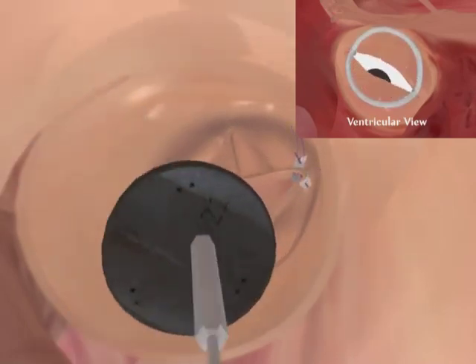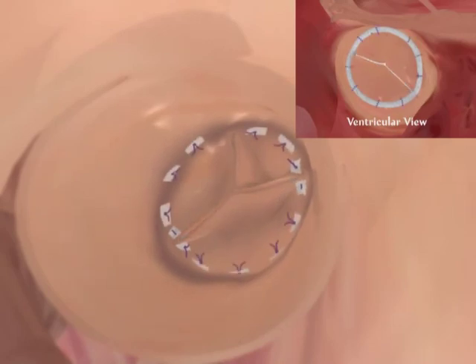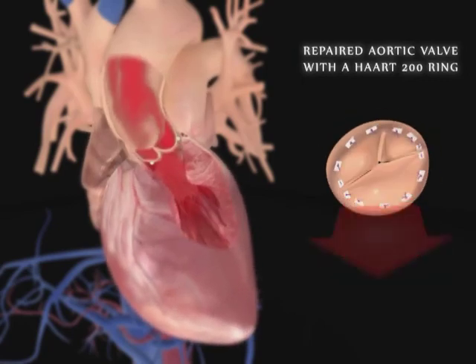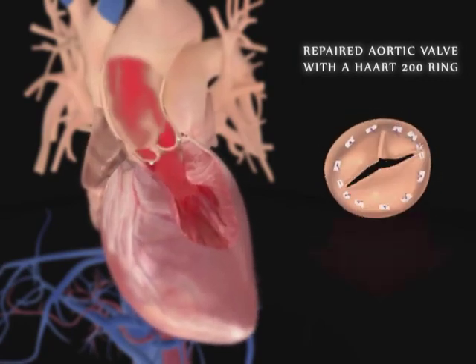For bicuspid leaflets that are not a 50-50 valve diameter split, additional leaflet surgical procedures are conducted to reconfigure the valve with 2 equally sized leaflets. Once the ring is in place and the appropriate leaflet alignment is established, the valve is once again competent with no regurgitation.